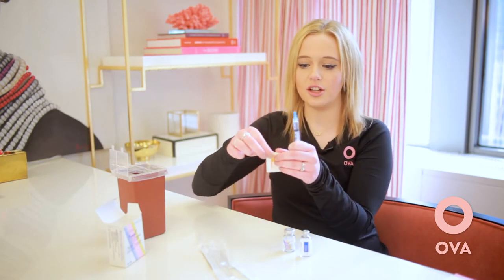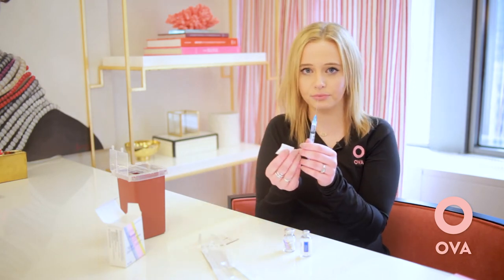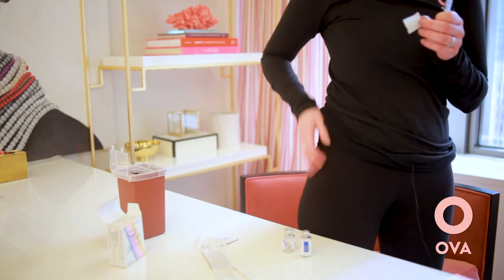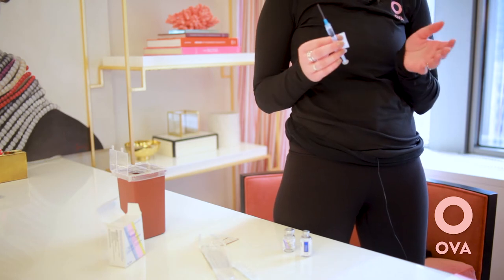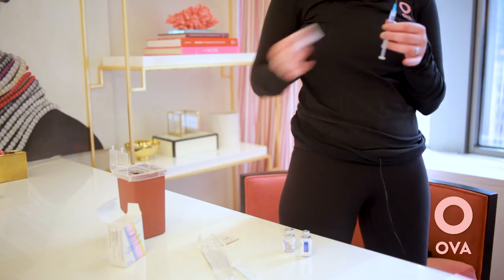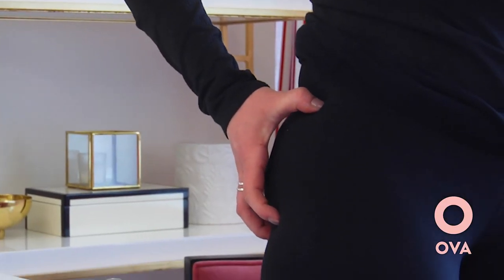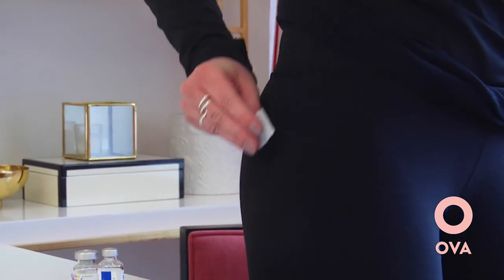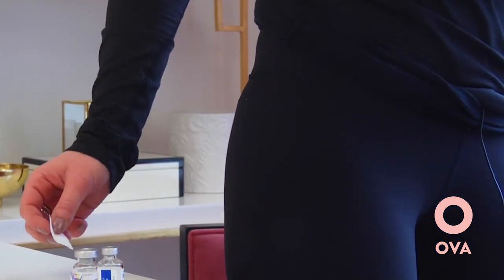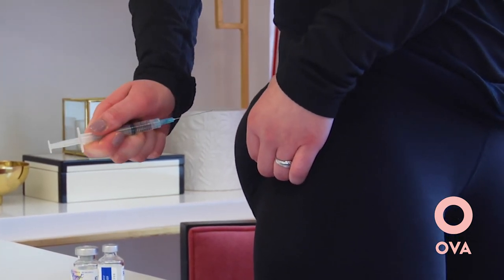Take your alcohol swab and get ready to clean the skin before you inject. The easiest way to do this is to stand up and get yourself in front of a mirror. If you're right-handed, go on your right side; if you're left-handed, go on your left side. For this injection, you're going to go in the upper outer quadrant of your butt. Go ahead and clean that area of the skin.